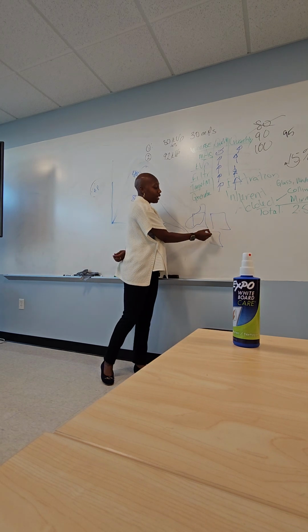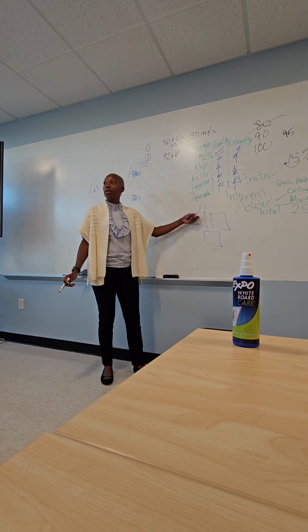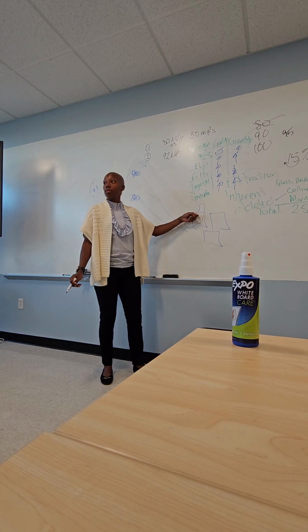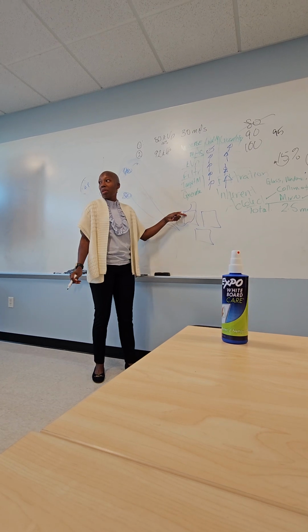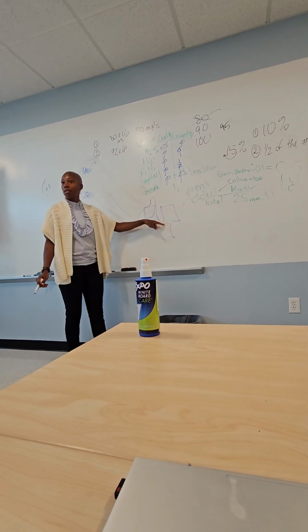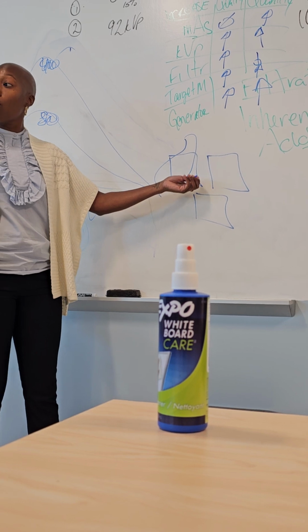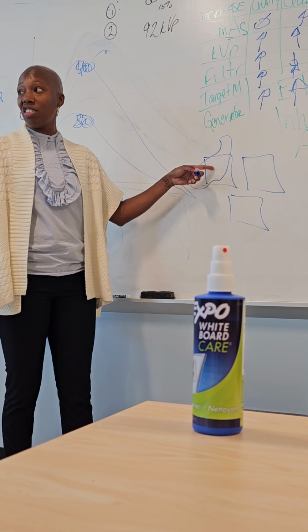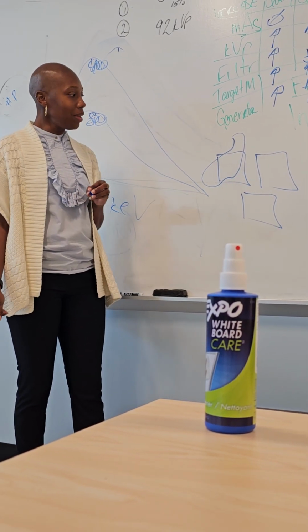So it's going to average out the energy over these 2 cells. It's not going to do anything to this one because it's covered, so it can't really have enough radiation reach it. So this will have all the radiation. This one will basically have absorbed it, right? It didn't reach the image receptor. This got it. So it averaged this out, and now these are what's going to cause this image to look overexposed. Although it terminated really fast, this is overexposed, and this is not overexposed. It barely got anything, it absorbed it, right?